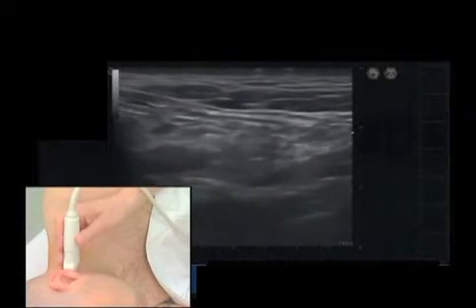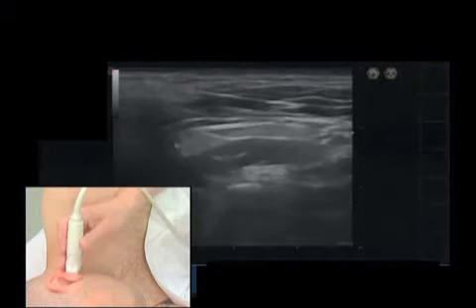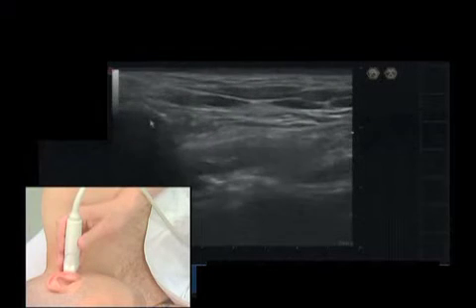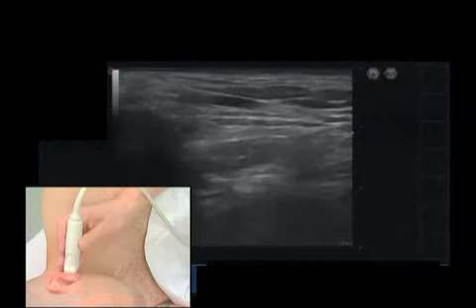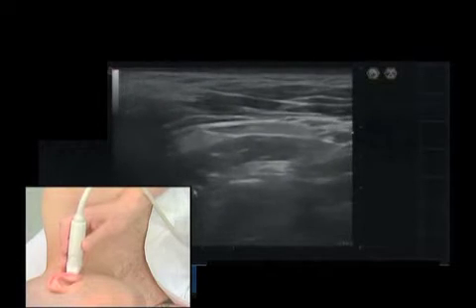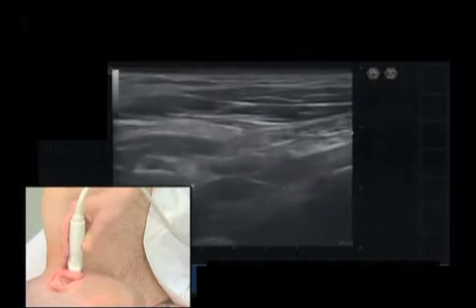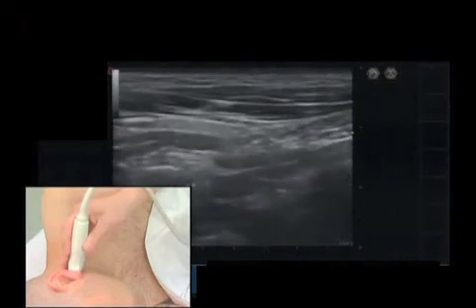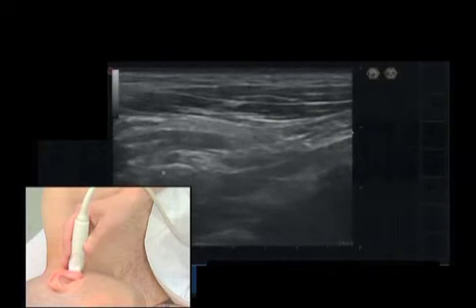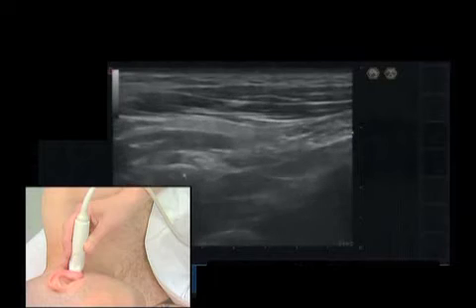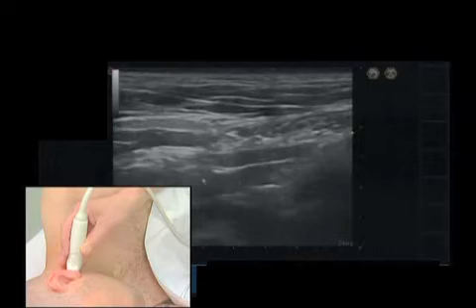Longitudinally, from the mastoid process, which is seen as a black shadowing on the left-hand side of the screen with a black shadow, you then move your transducer anteriorly just until you see the bright reflex of another bony contour — this is the bright reflex of the transverse process of atlas.